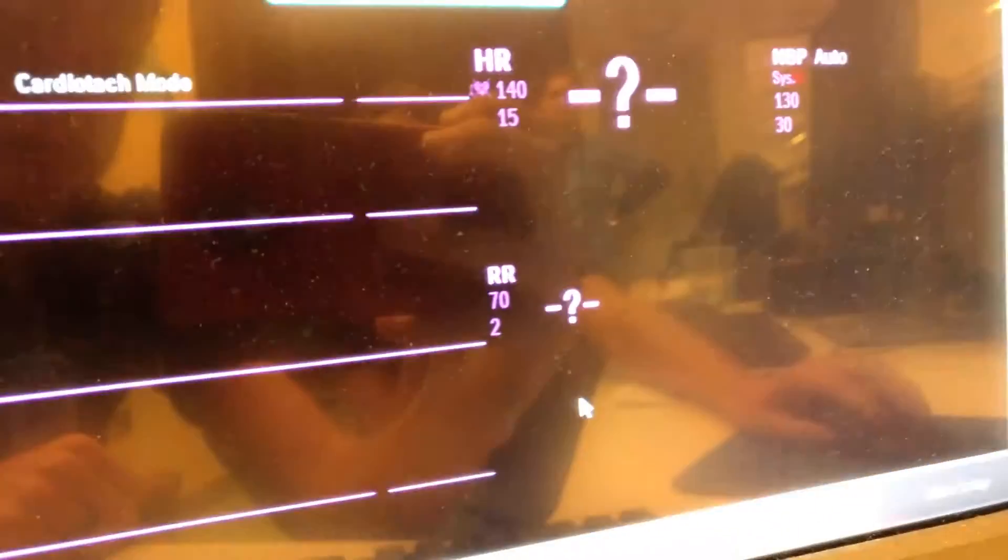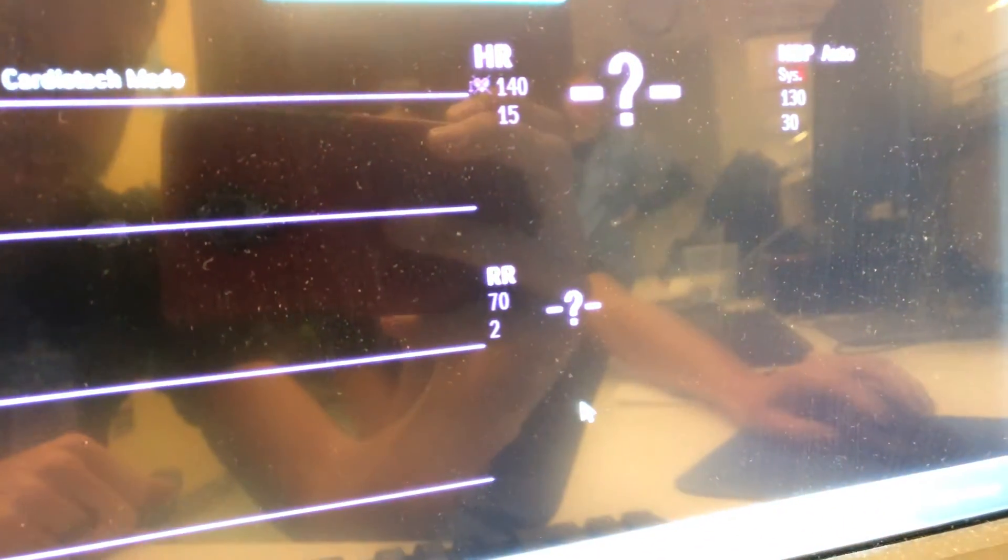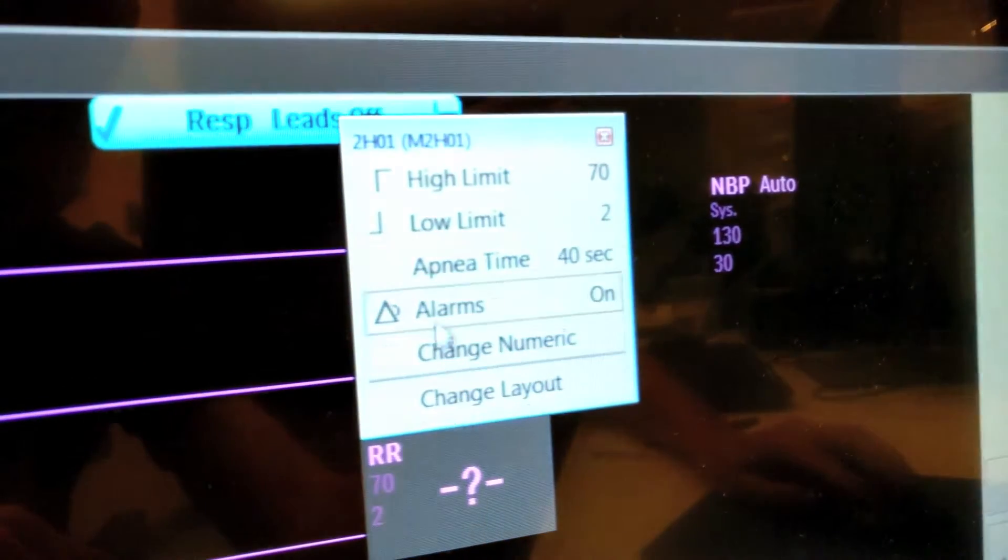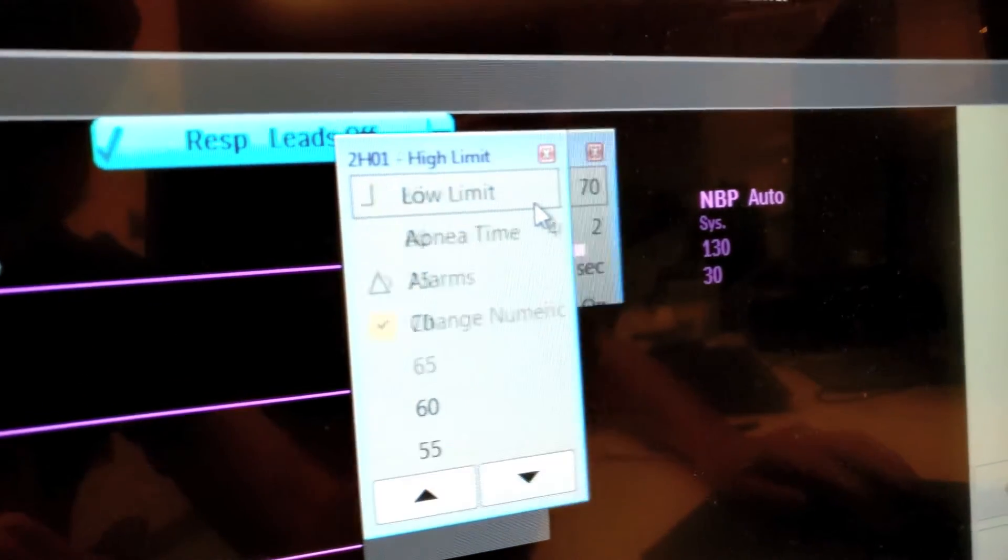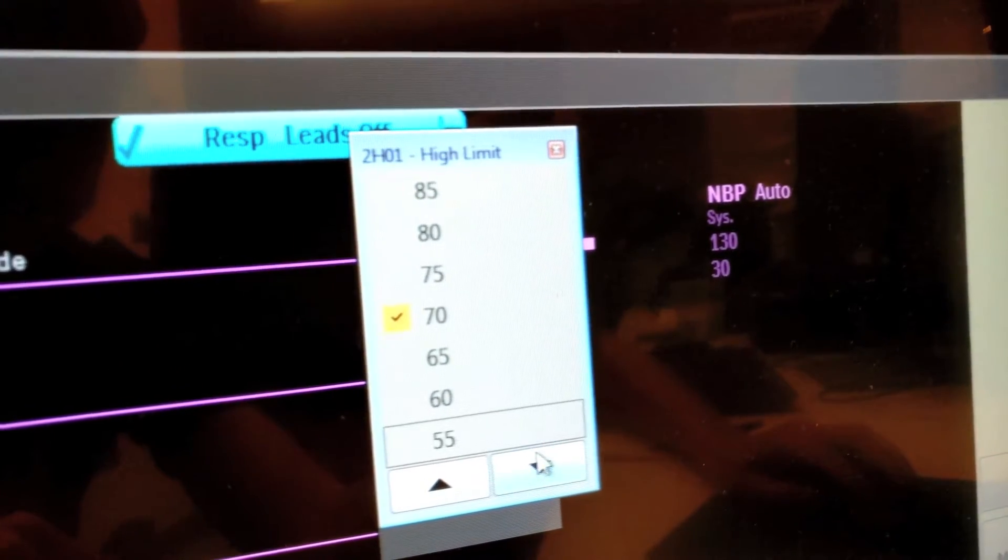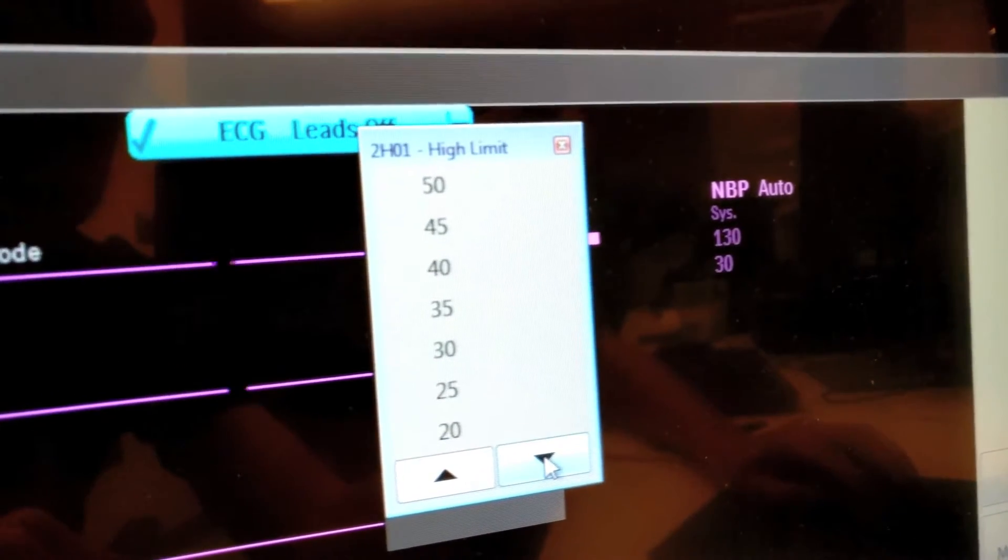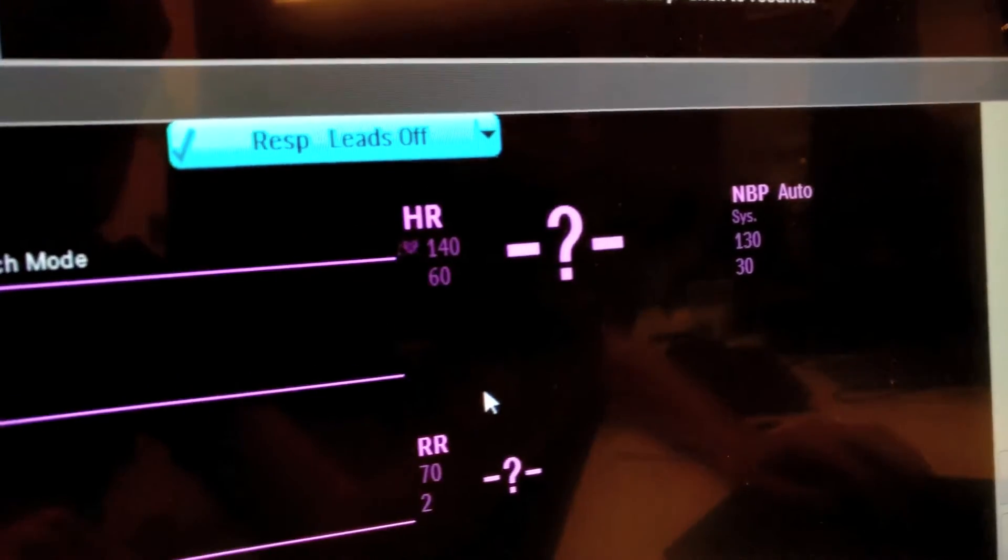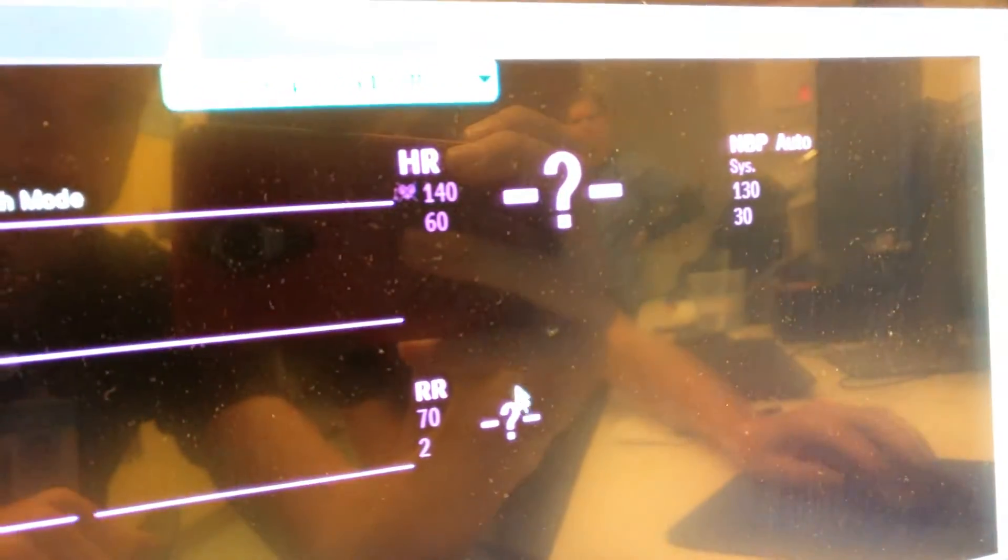Also make sure appropriate alarms such as the irregular heart rate and AFib alarms are turned back on. All alarms will still ring at the nurse's station if you set them, but they will not sound in the patient's room.